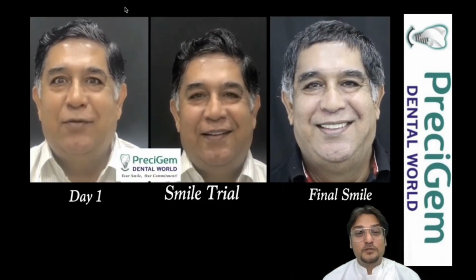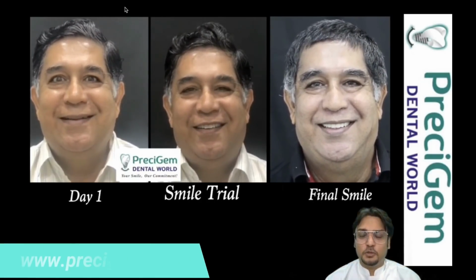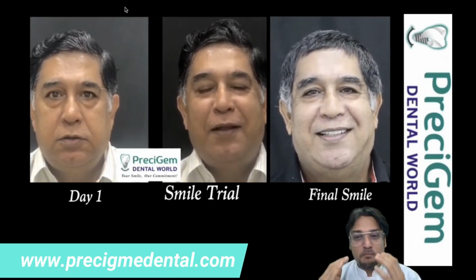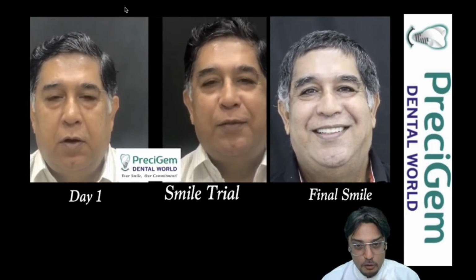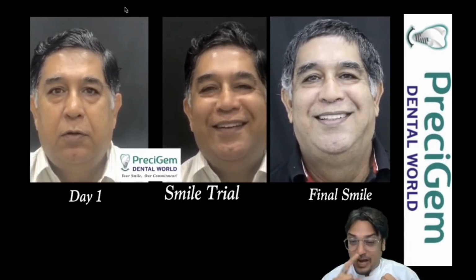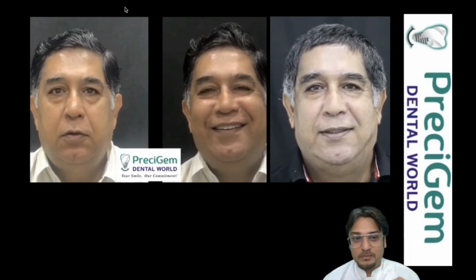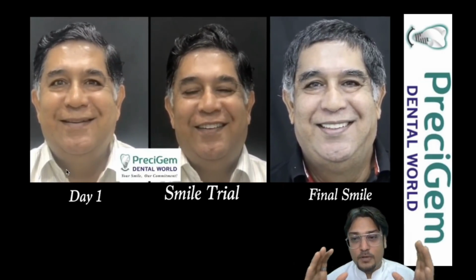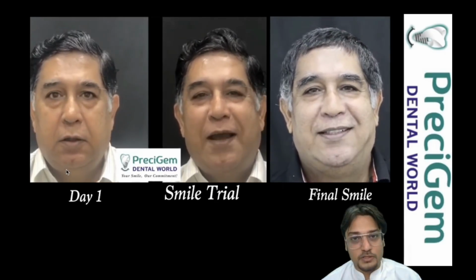So my friends, please go through the difference between day one, just the smile trial where only upper teeth were shown just to give you confidence, and the final smile of the patient where upper and lower teeth are all addressed. Now you can see the drastic difference in the confidence level of the patient, in the smile display of the patient. Here in the upper image, all upper teeth are properly visible, whereas in the first pre-op one, only lower teeth are visible. Here the proper smile is designed beautifully with the help of computerized digital smile designing protocols.